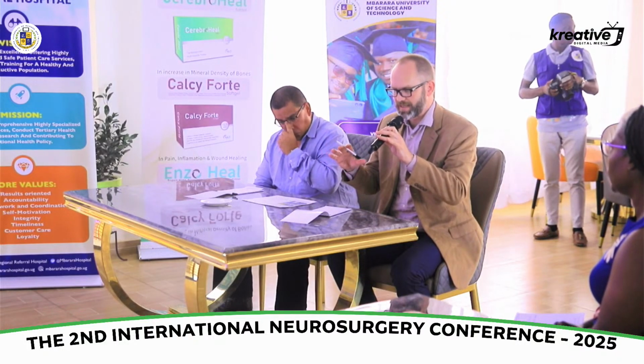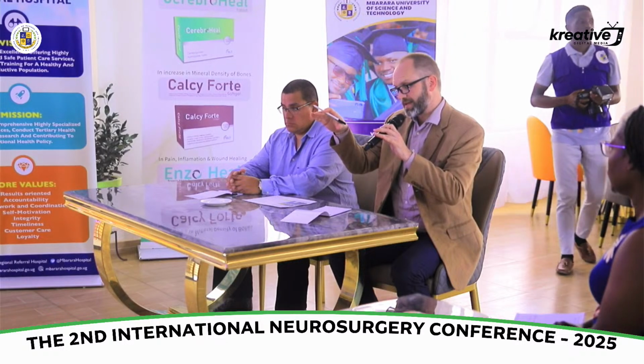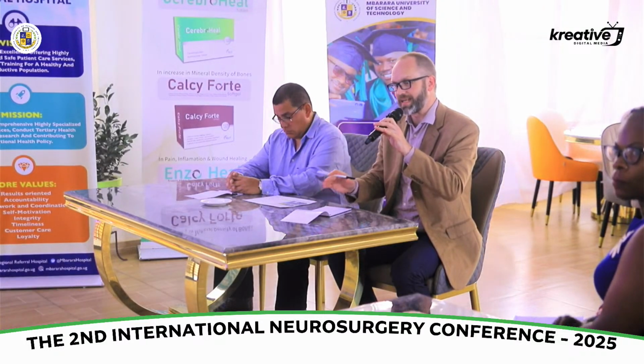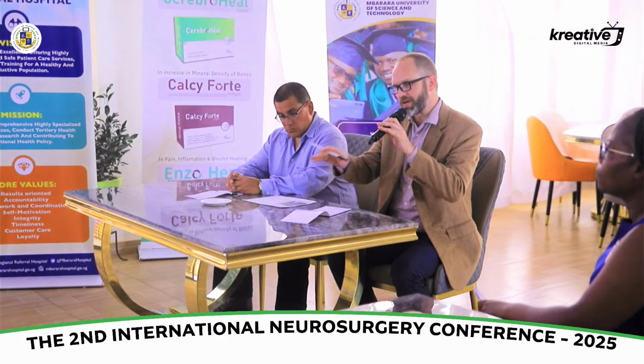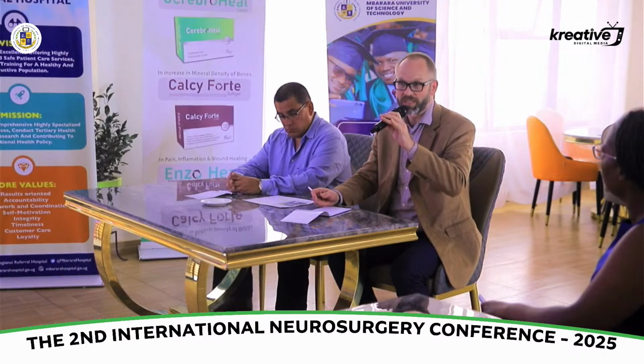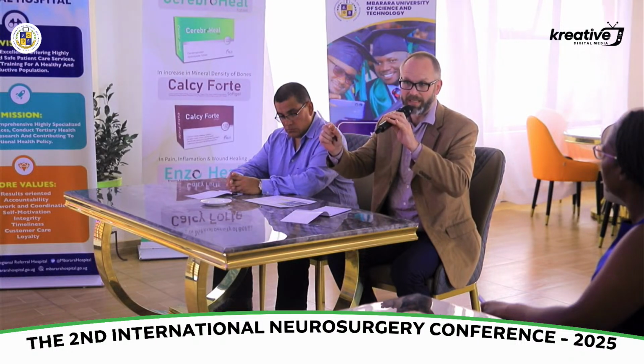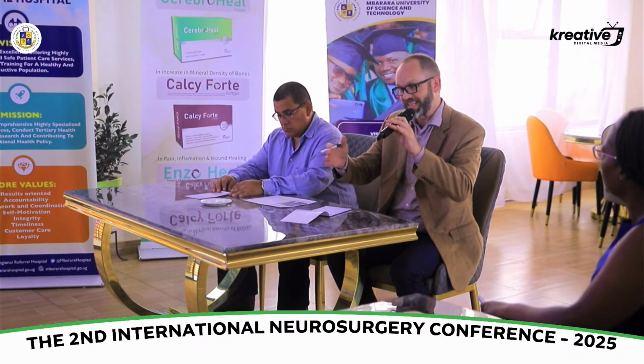At any rate, ultrasound localization microscopy takes contrast ultrasound and then uses AI algorithms to actually track microbubbles across the screen over time, so you can get a tenfold decrease, down to the less than 10 micron level, you can see blood vessels. So below the resolution of ultrasound, about half the wavelength of ultrasound, you can now pick up capillary beds. So that needs AI to even be able to function, but it still takes hours.